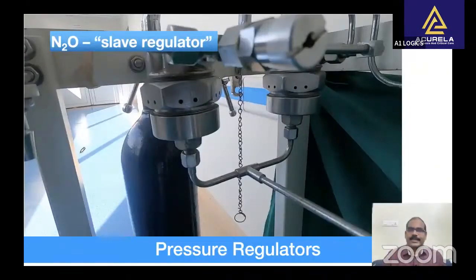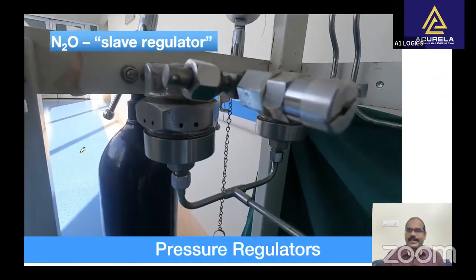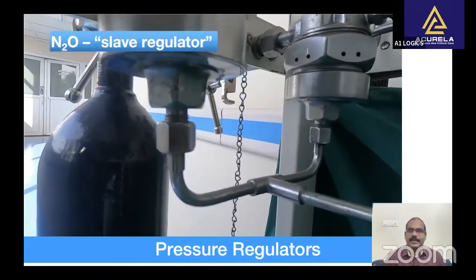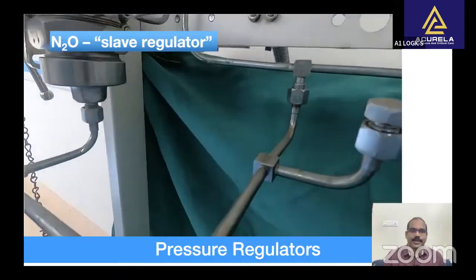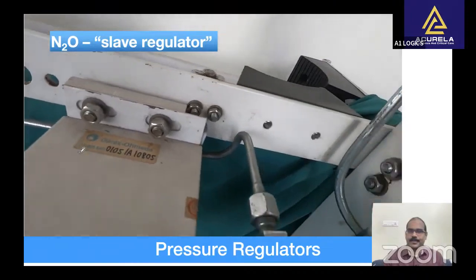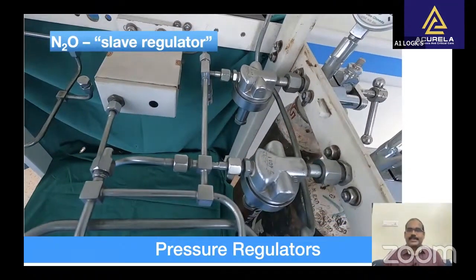Here you can find the nitrous oxide pressure regulator is a slave regulator, since the mainspring in the nitrous oxide regulator is replaced by the oxygen pressure. You can see the tubing getting traced to the oxygen pipeline. So, when the oxygen line is not pressurized, there will not be any output from the nitrous oxide pressure regulator as a safety feature.